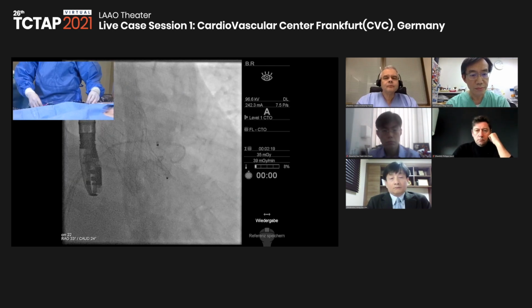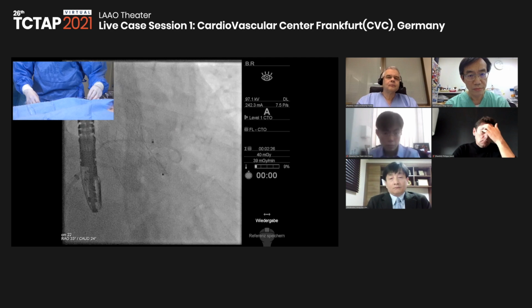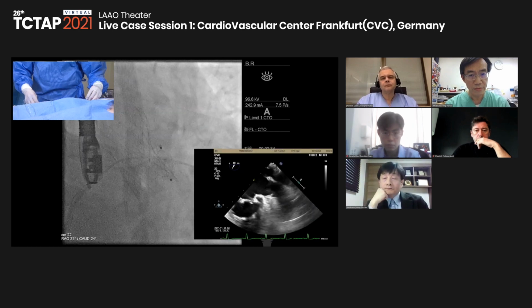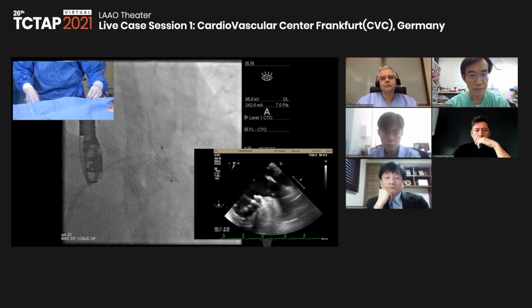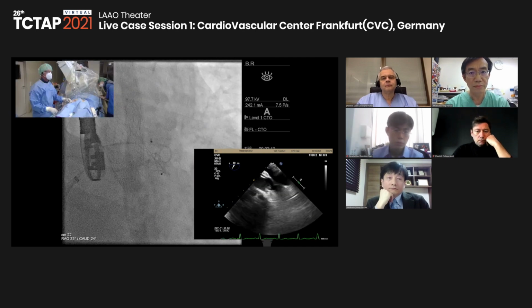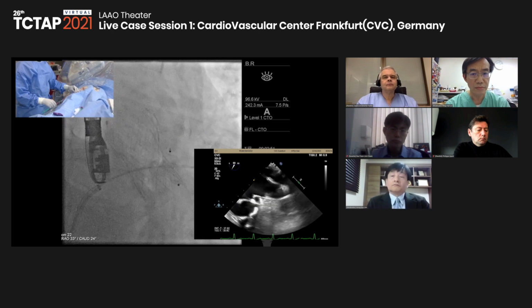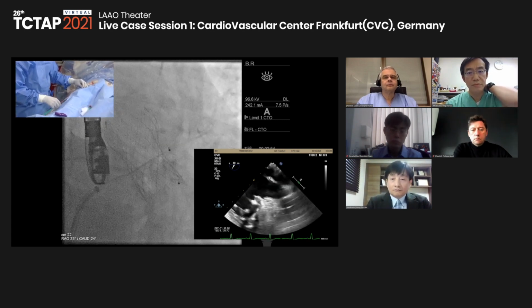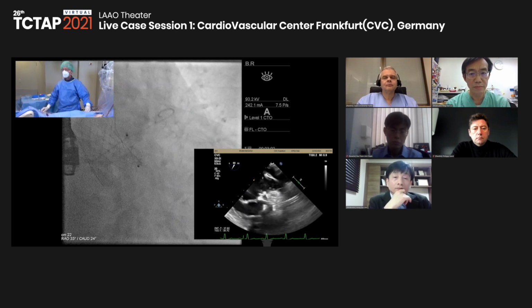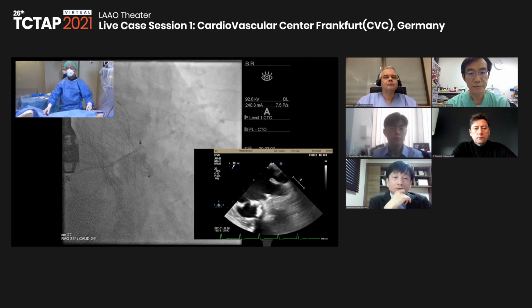So let's try to get more into the appendage here. I pull back the sheath a little bit. No. I'm in an inferior lobe. I would like to go to a more cranial lobe, anterior lobe. Okay. Now let's take a cine.